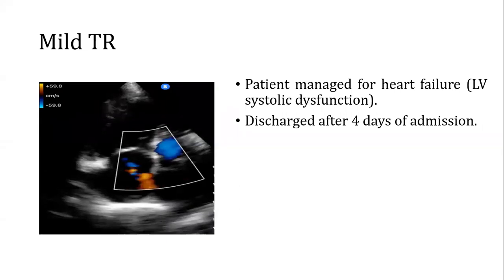But thankfully, we have also rescued this patient by going ahead to do lung ultrasound, which shows us actually this pleural effusion that you are calling small, it's much more. But since the rest of the lung is normal, apart from the pulmonary edema, we finally ended up doing an echo, and lo and behold, the left ventricular failure is what we find. Patient is managed and is fine and well.